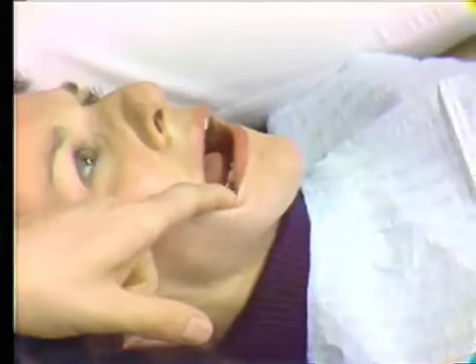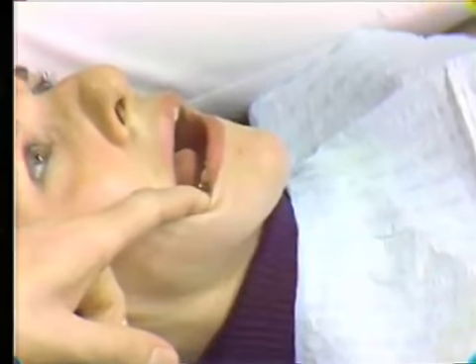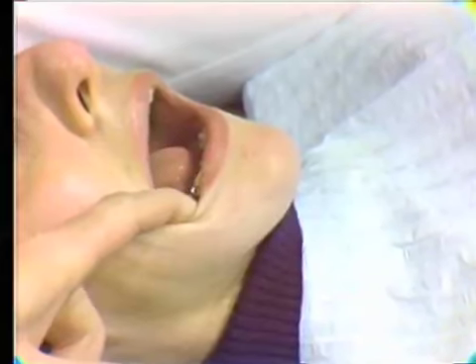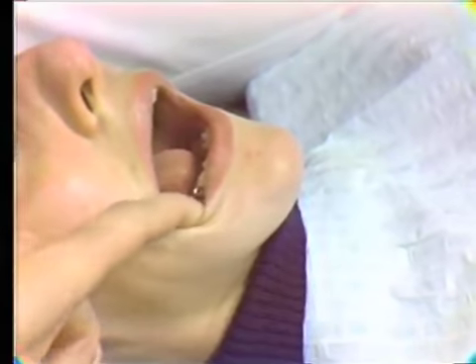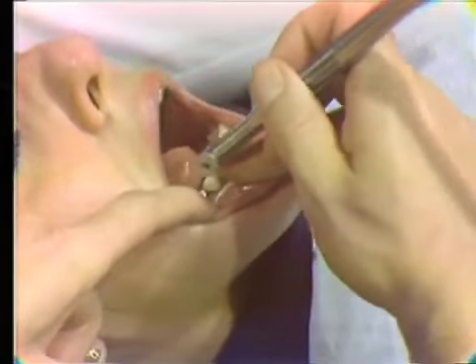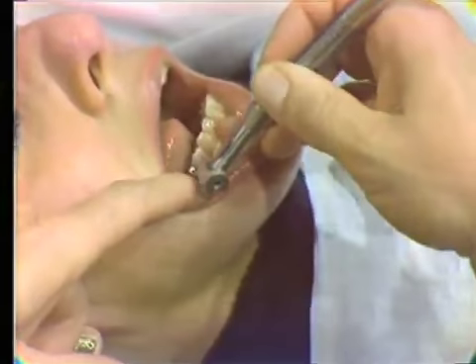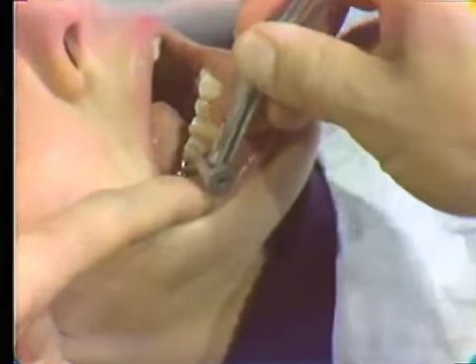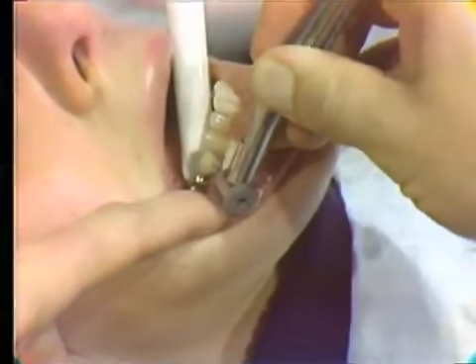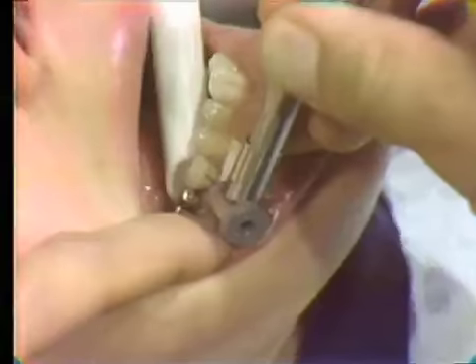Retraction can be accomplished with the operator's left index finger in the bicuspid region, whereas a mouth mirror is often more helpful in the more posterior areas because it is thinner and allows more space for the head of the handpiece. A finger rest can be established on the labial surfaces of the mandibular anterior teeth. The evacuator tip is placed lingual to the tooth being treated with 1/2 of the opening beyond the occlusal surface.